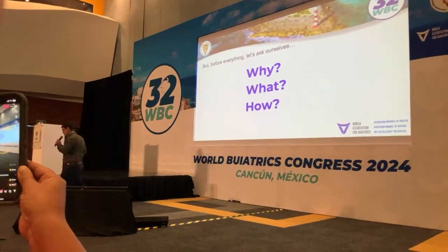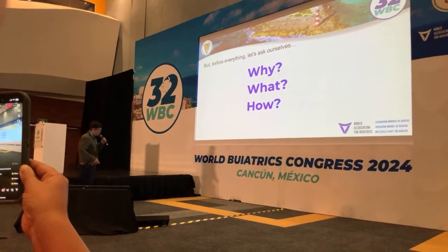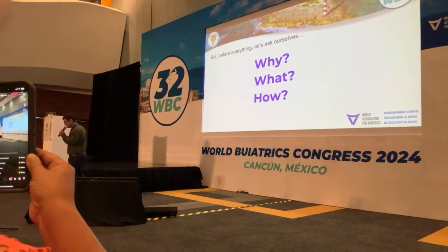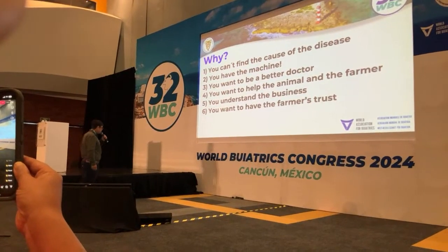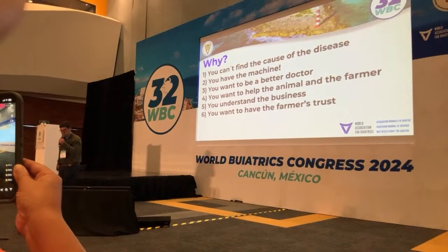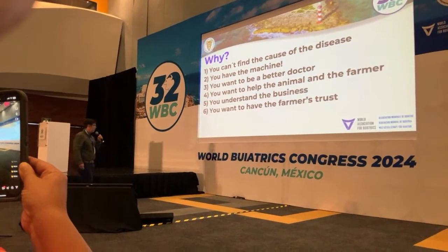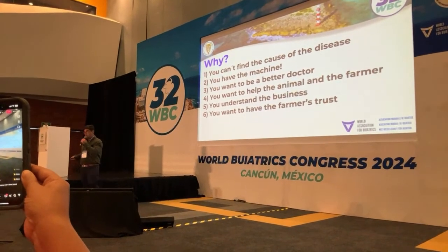But before everything, we have to ask ourselves these 3 questions. Why utilize this type of exam? What to scan? And how to perform the technique? To answer the why: first, you can't find the cause of the disease after doing the clinical exam. You have the machine, obviously. You want to be a better doctor.